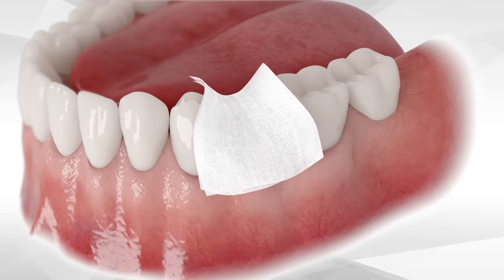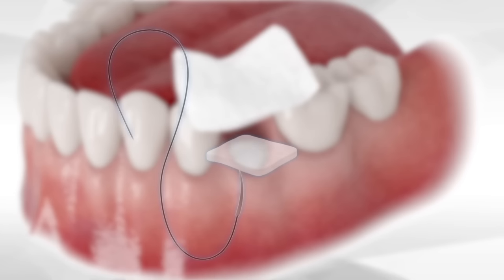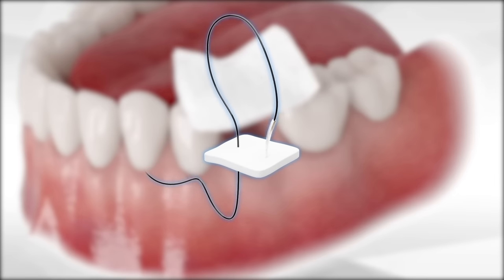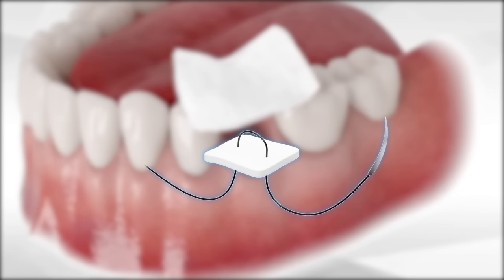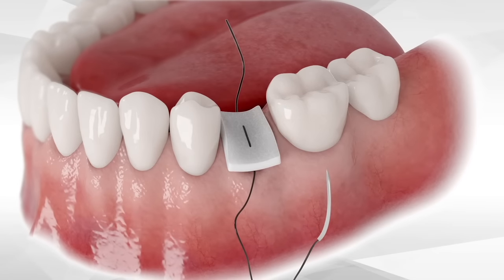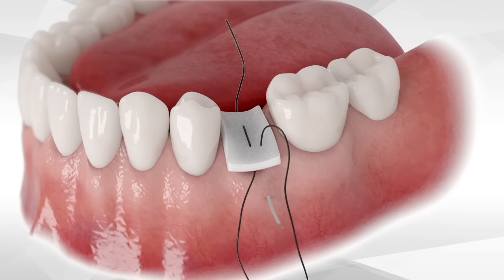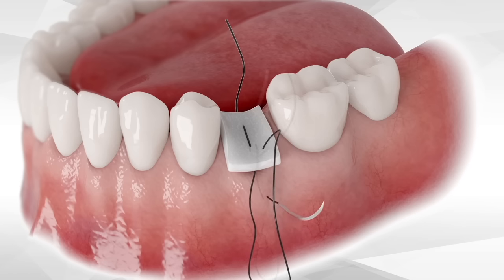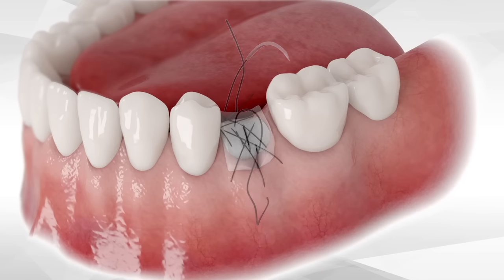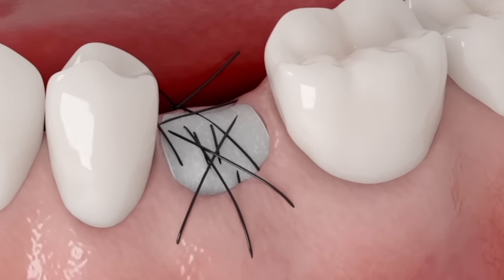Once the gauze is removed, the exposed graft should be protected by a simple collagen sponge or a collagen plug. Pass a suture through the sponge outside of the oral cavity and introduce the needle from one side to the other. Then place it on the socket and secure it to the soft tissue with the first suture. Suturing is done buccally and then lingually. Make the first suture and then cross-suturing above the sponge. It is very important that the sponge or plug will be sutured and secured in place until soft tissue proliferation will take place.